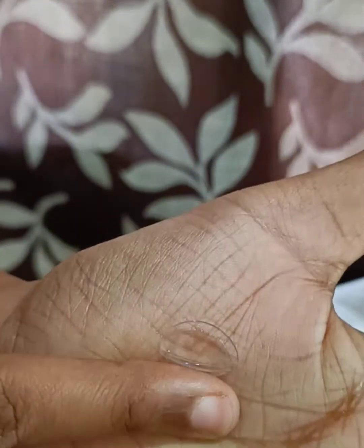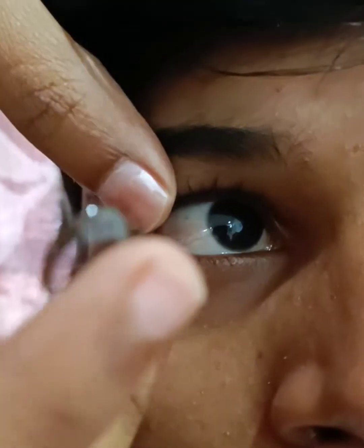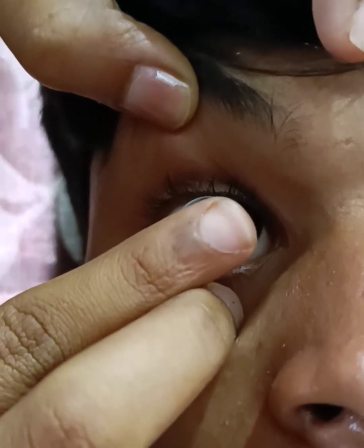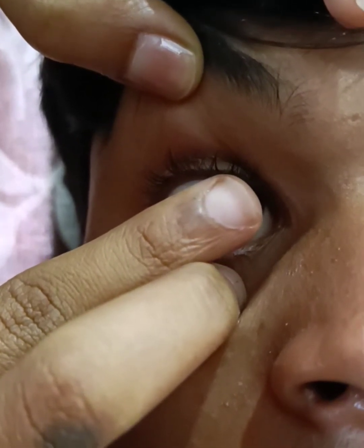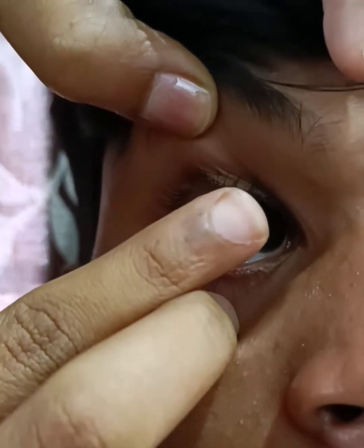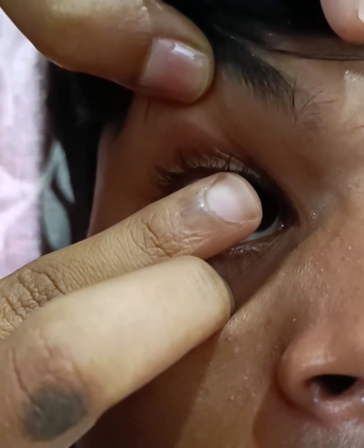Next is the insertion of the contact lens. The contact lens is mostly 14mm in diameter for comfortably landing on an eye. You have to take the contact lens and ask the patient to look on the nasal side. At that time you have to make the eyelid open and try to put the contact lens at the center.